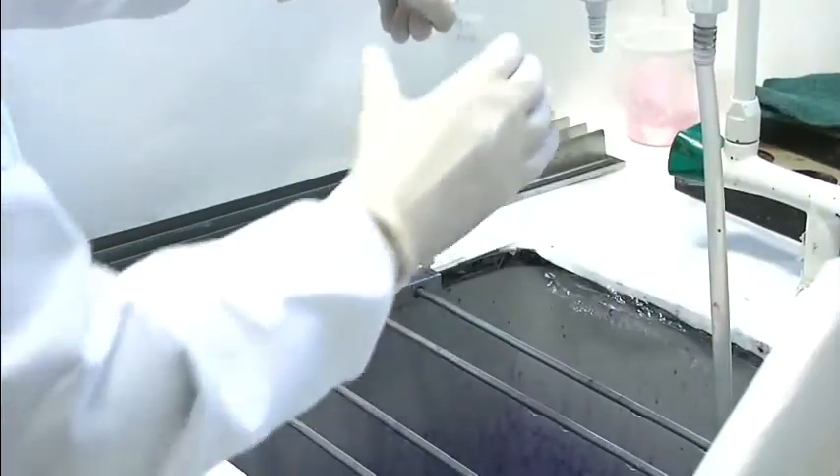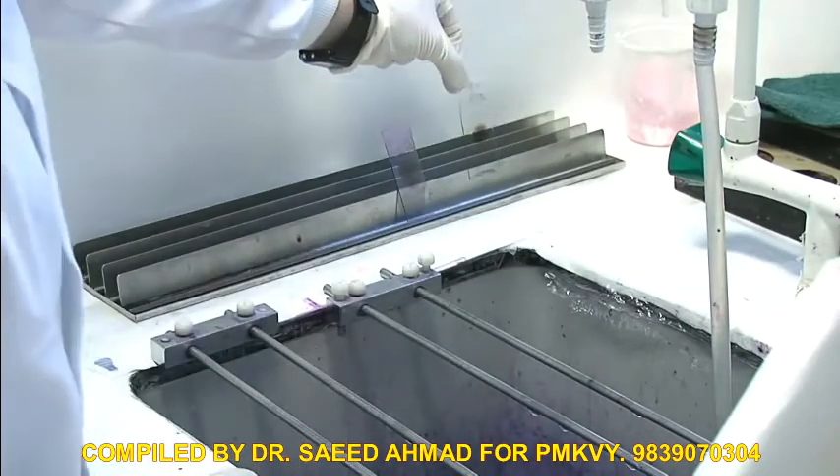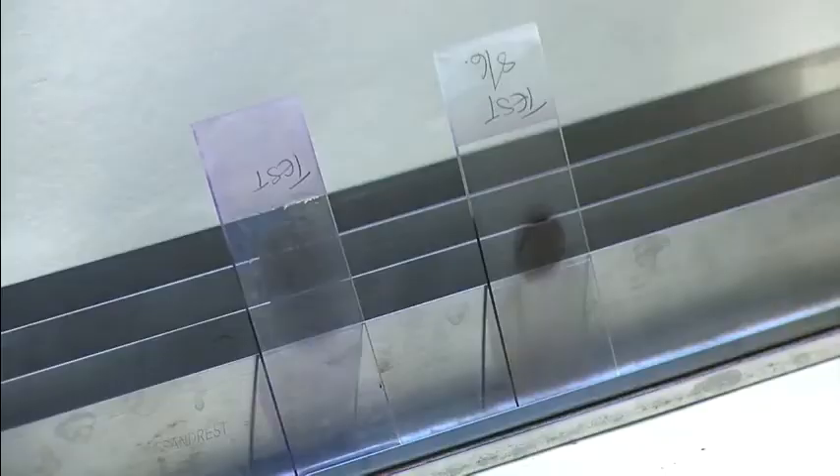Place it upright in the rack to dry, so all the outside of the red cells can come down and leave a nice clear area to look at.